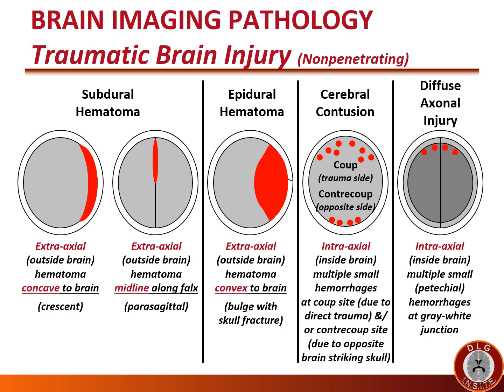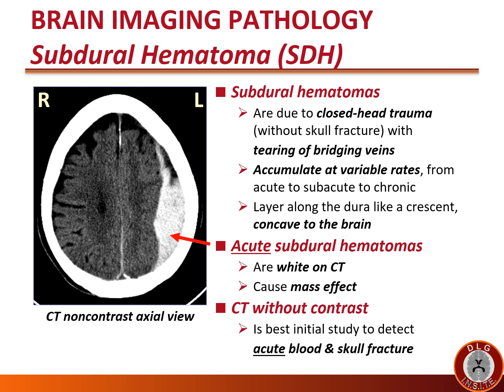This non-contrast CT shows a left subdural hematoma. Subdural hematomas are due to closed head trauma without skull fracture, with tearing of bridging veins. They accumulate at variable rates — acute to subacute to chronic — and layer along the dura like a crescent concave to the brain when lateral. Acute subdural hematomas are white on CT and cause mass effect. CT without contrast is the best initial study to detect acute blood and determine if there is a skull fracture, though subdural hematomas are generally not associated with skull fractures.